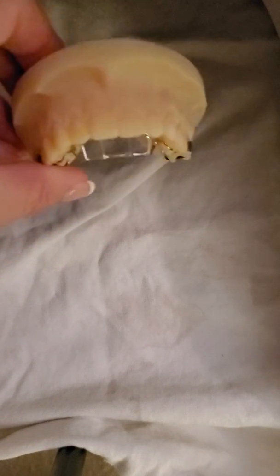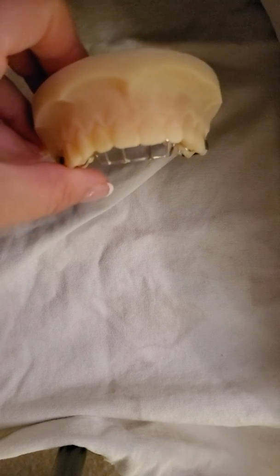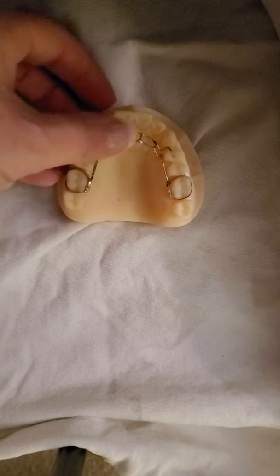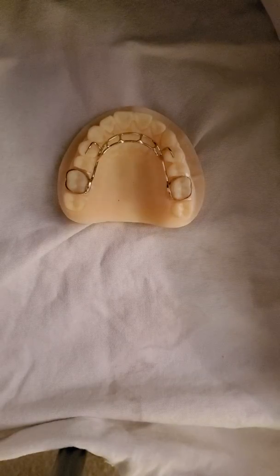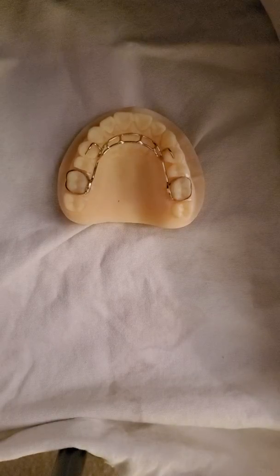So you can see what it looks like from the front. I mean, it's a little visible, but not that visible. You can also have the crib embedded into a removable appliance as well, like a Schwartz, a sagittal, or a retainer, a Hawley. So many things that you can do.